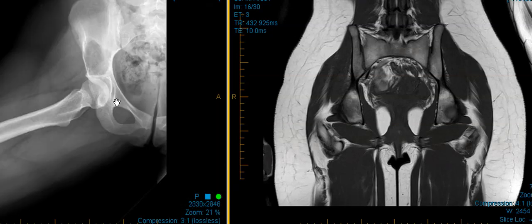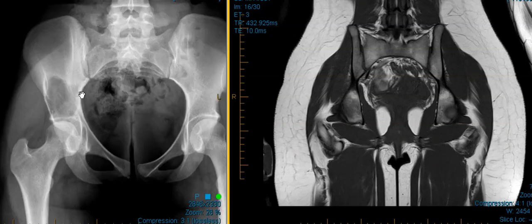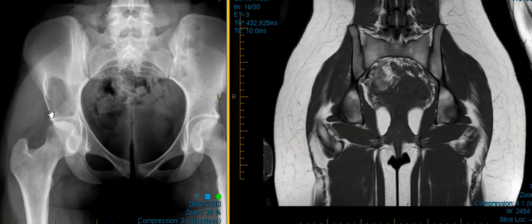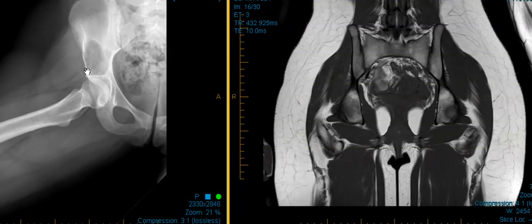She was limping, and they did an x-ray here, and we see that there's a big lytic bone lesion — a lucent area right here in the ilium. This is the ilium, and the part that articulates with the hip joint is called the acetabulum, this acetabular roof. So a large bone lesion here, and we can see it on this view with the femur out — there it is.